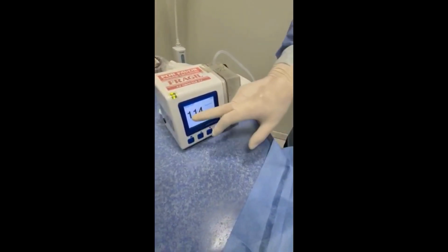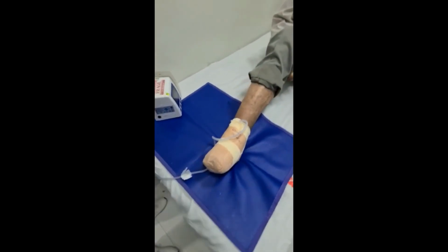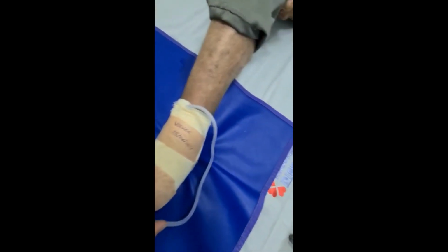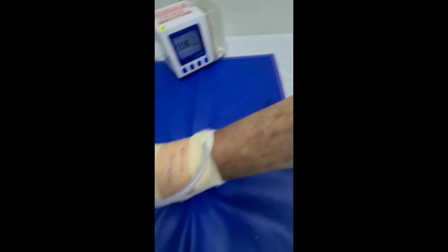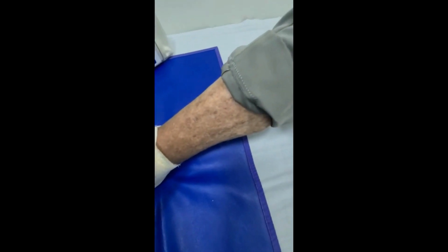When the pressure drops, the device activates and starts suctioning. We already have it sealed. The patient's wound, I put a date here for him to return in about 15 to 20 days. The little device is working well. We still don't have secretion aspiration because it's a wound with scarce to moderate output.